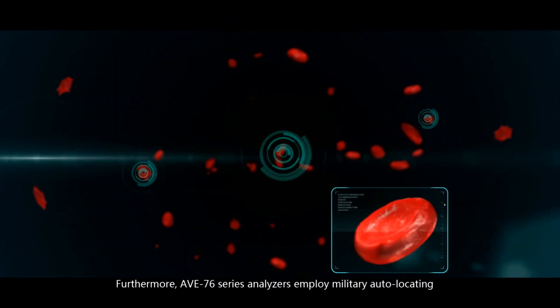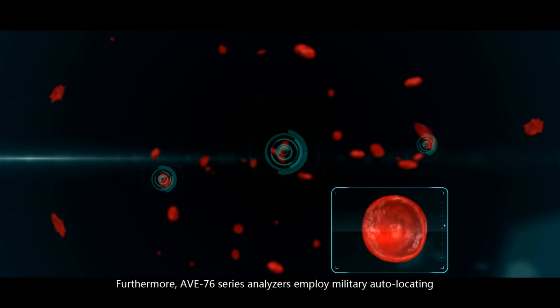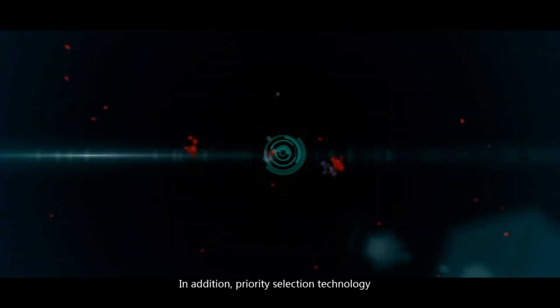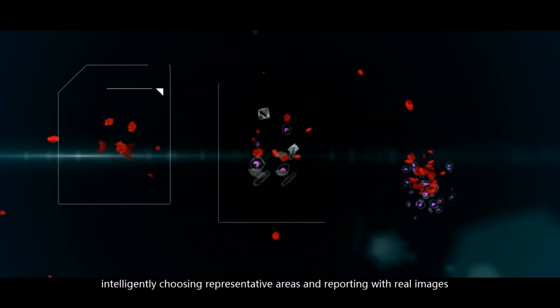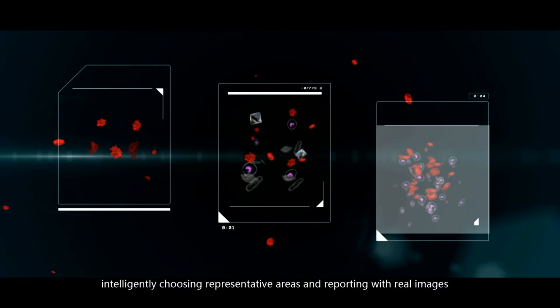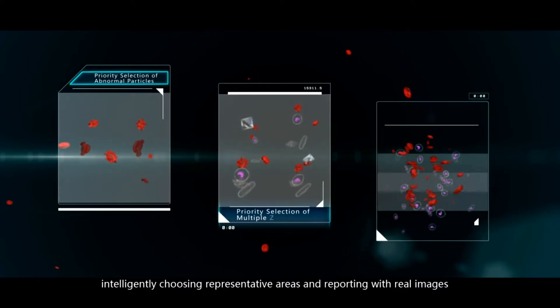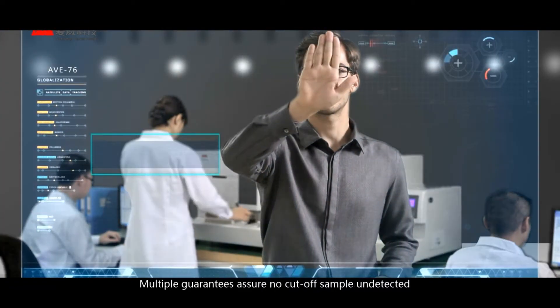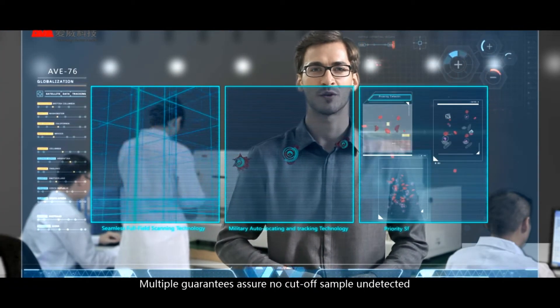Furthermore, AVE-76 series analyzers employ military auto-locating and tracking technology to prevent particles from being undetected. In addition, priority selection technology intelligently chooses representative areas, and reporting with real images prevents particle types from being undetected. Multiple guarantees ensure no cut-off sample undetected.